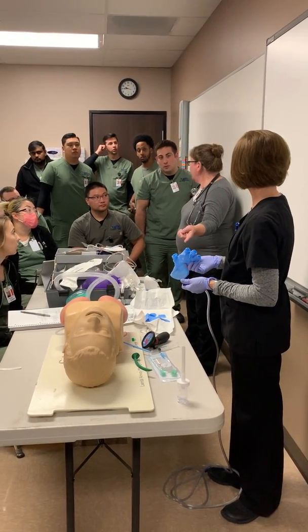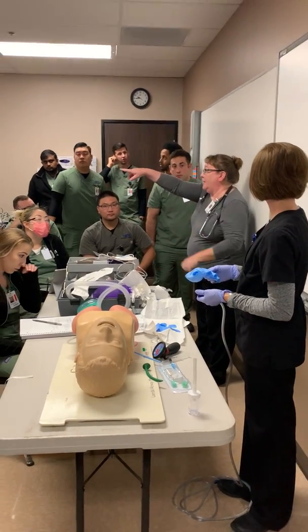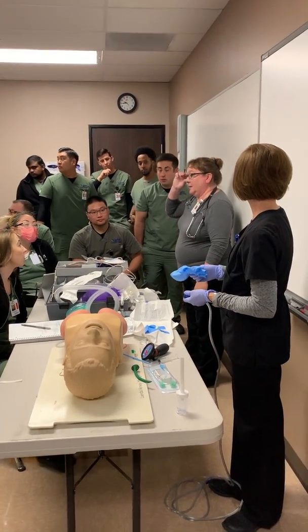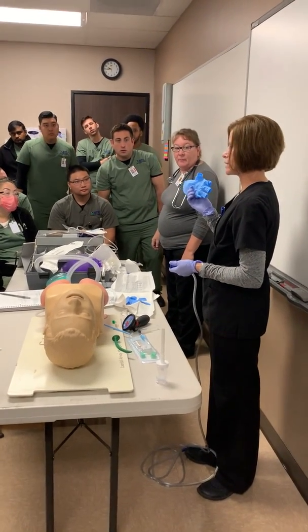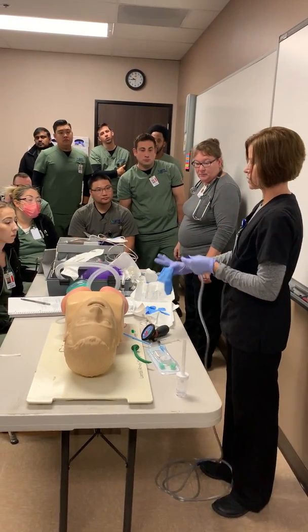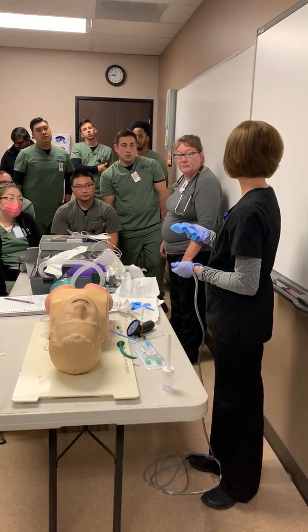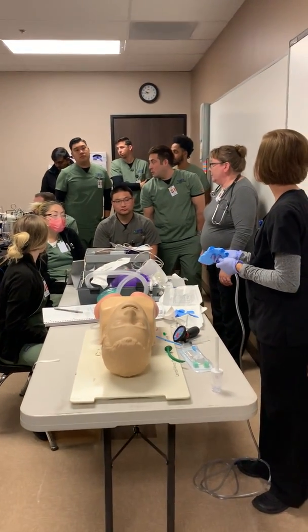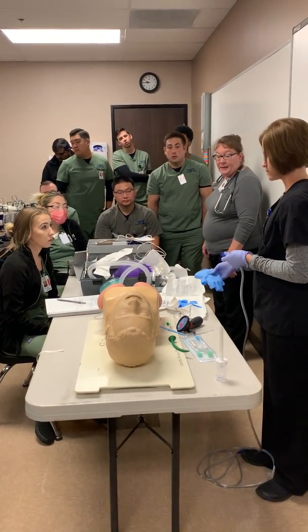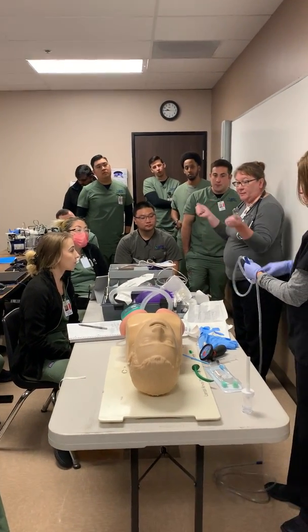If you know those gloves don't fit your hands, then you get a pair of sterile gloves, and we have them in the cupboard above the sink, because in term 4, you're going to learn how to do sterile everything. Usually these are bigger than anything else. If you have small hands, then you'll have extra material to spare. It seems like they always are bigger than small. I've seen them break a lot. So you could just get a regular pair of sterile gloves in the back, and then you would just open them the same way.